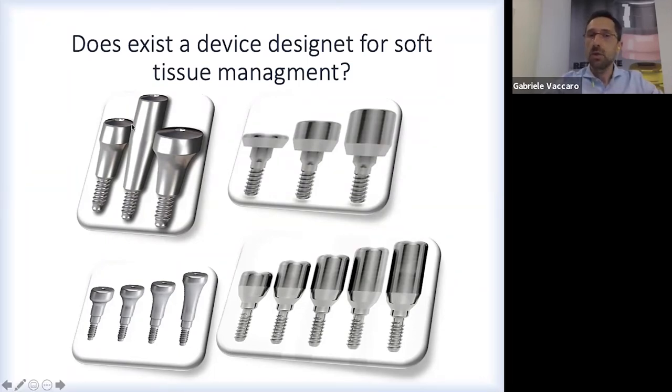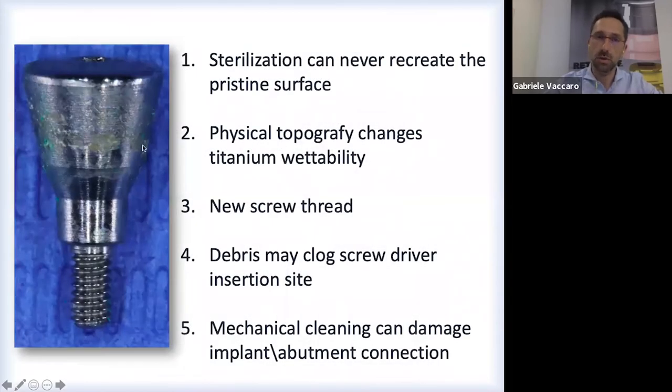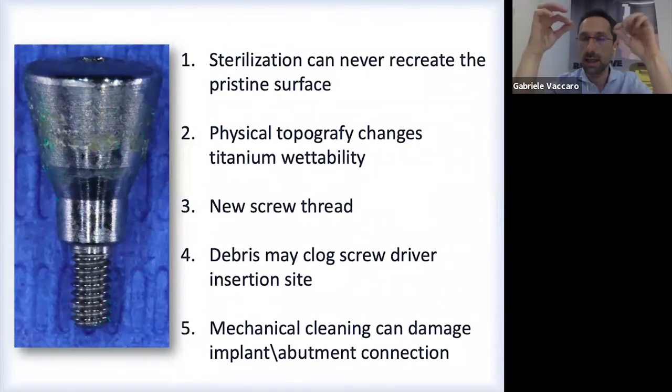The best would be to have the permanent healing screw over our implant. And this is exactly what I want to say. Talking about healing screws, we have to consider that they are designed for one single use only. If you open a sleeve with a healing screw inside, it is written very clearly: single use only.